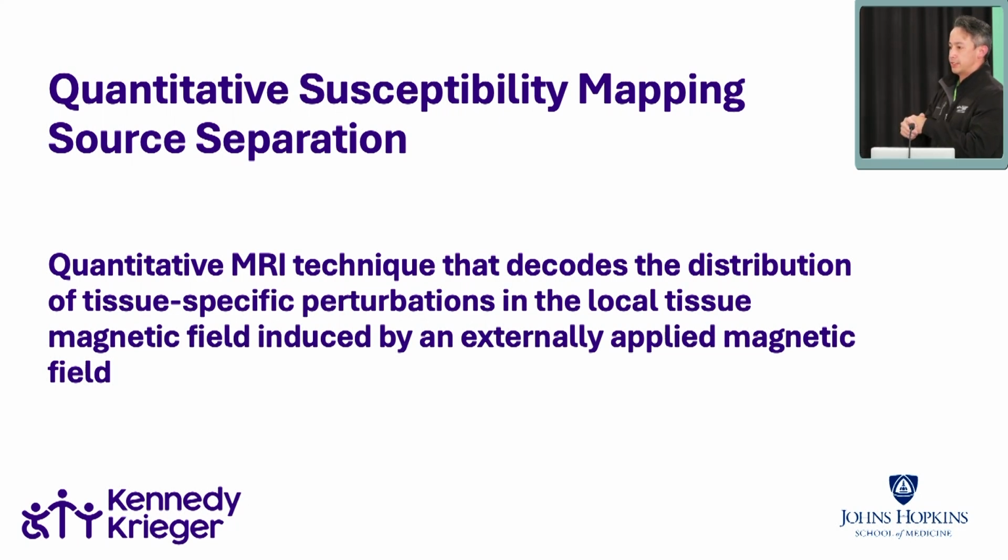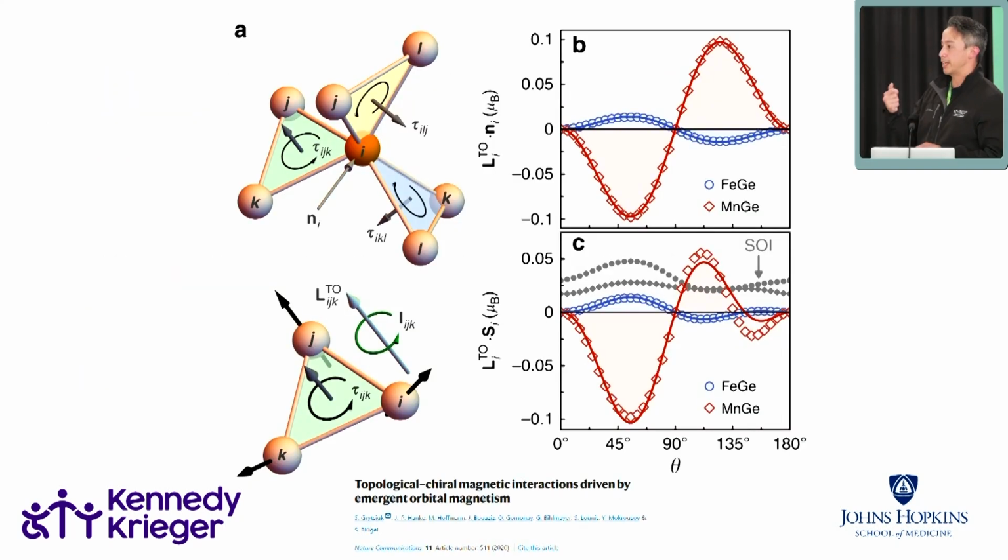In the most basic sense, all the molecules that are in your head are, to some degree, susceptible to magnetic fields, right? We're made of atoms and molecules and organic things, and every atom, molecule, compound that you have in your body generates a small magnetic field to some degree, whether it's a tiny one or a larger one. So if everyone remembers, like from physics, like the right-hand rule, like things spin and then they generate a current, they generate a magnetic field. Every molecule in your brain does this.